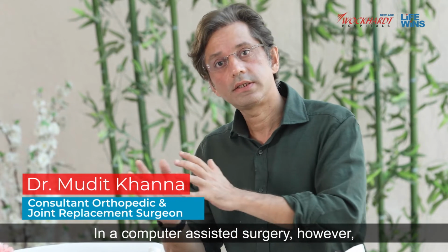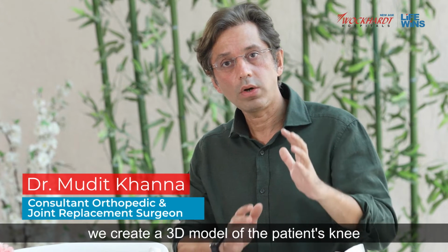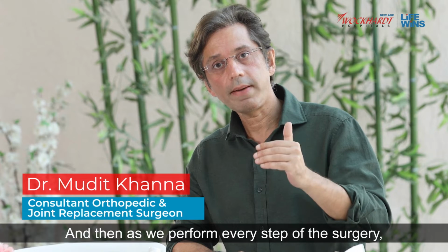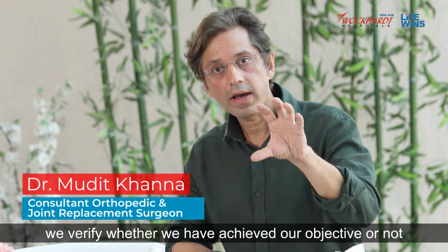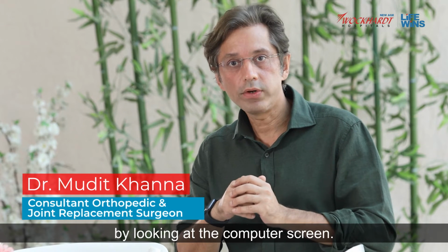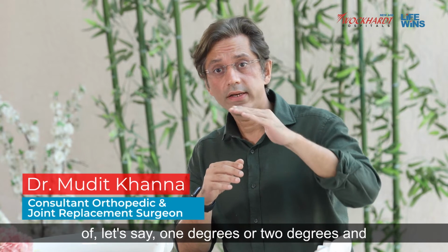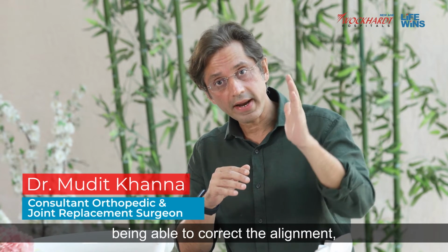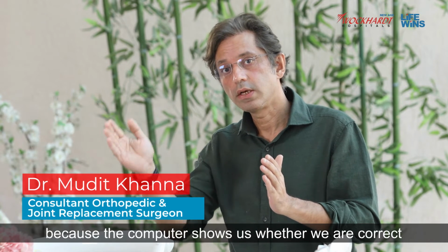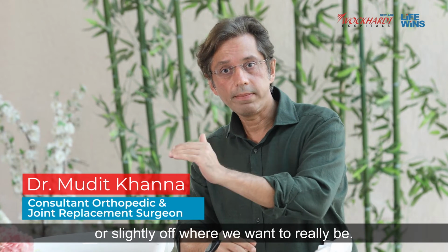In a computer assisted surgery, however, we create a 3D model of the patient's knee on a computer, and as we perform every step of the surgery, we verify whether we have achieved our objective by looking at the computer screen. Even if we have a minor error of, let's say, 1 or 2 degrees in correcting the alignment, we are able to spot it because the computer shows us whether we are correct or slightly off.